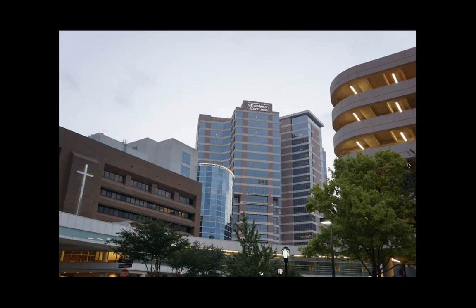No, Raju, I think this was an excellent case, and thank you for presenting it, and thank you to Dayali for participating. I think it really added an extra layer of information and education.